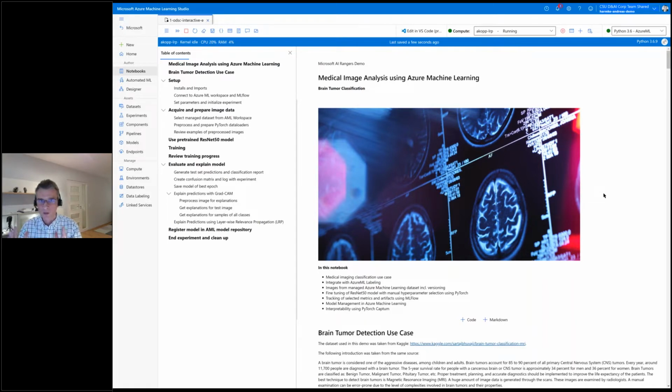So I want to have all this flexibility that I'm used to from my data science use cases, but I also want to leverage a collaborative workflow. So I want to interact with my coworkers, and in particular, in terms of compliance, I have to manage all those assets like data sets. So this is what I'm leveraging the ML platform for.